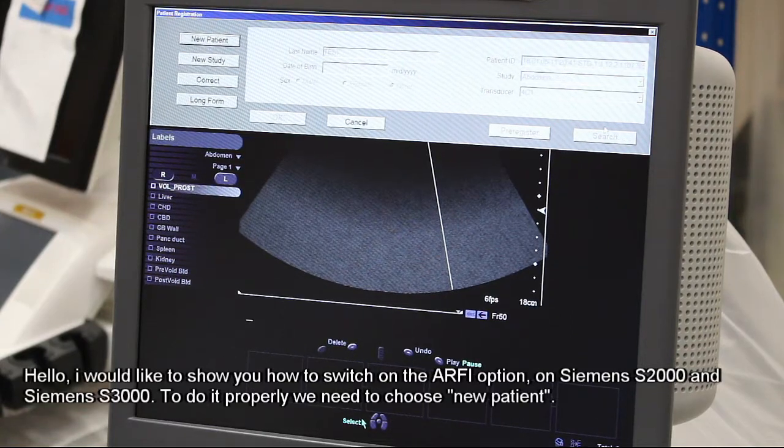Hello, I would like to show you how to switch on the ARFI option on Siemens S2000 and Siemens S3000. To do it properly, we need to choose new patient.